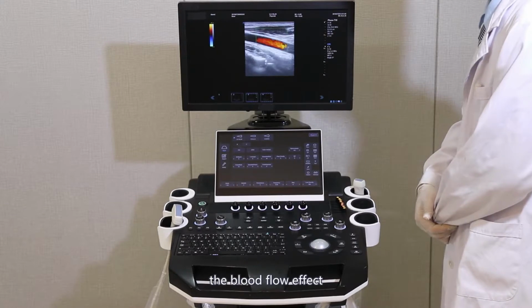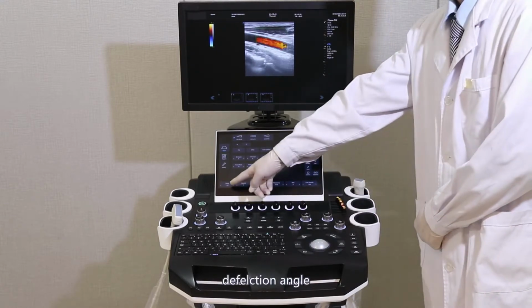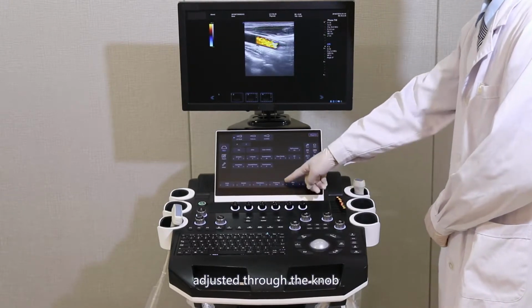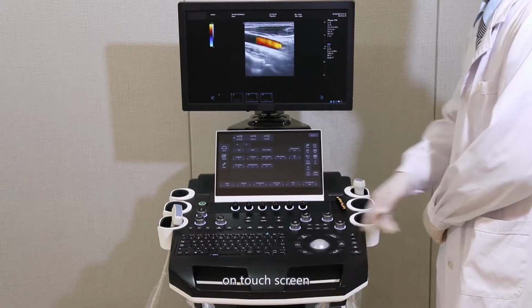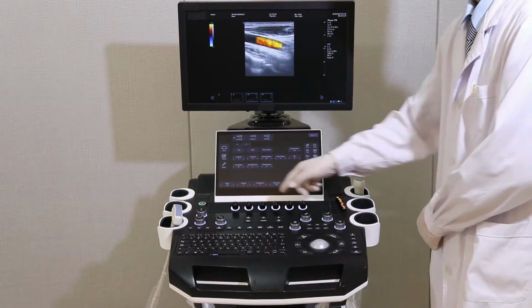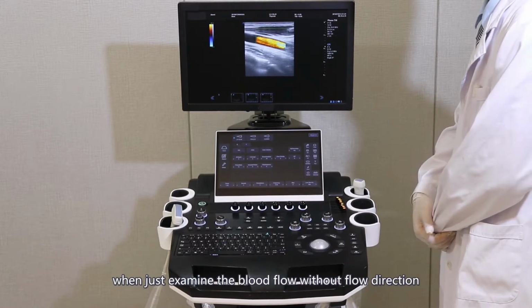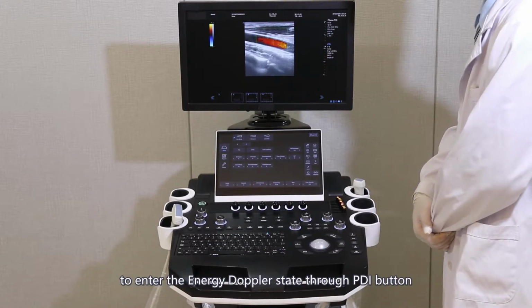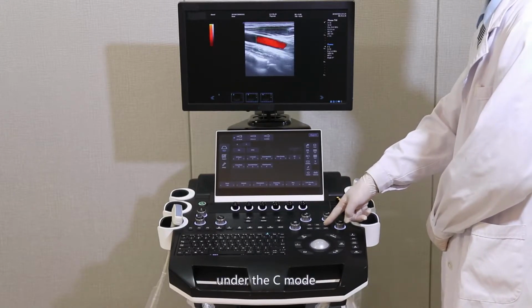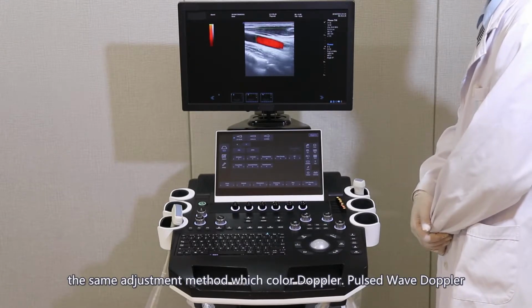The blood flow effect, scale, and deflection angle under the linear array probe are adjusted through the knob on the touch screen. When examining the blood flow without flow direction, enter the energy Doppler state through the PDI button under the C mode. The adjustment method is the same as color Doppler.